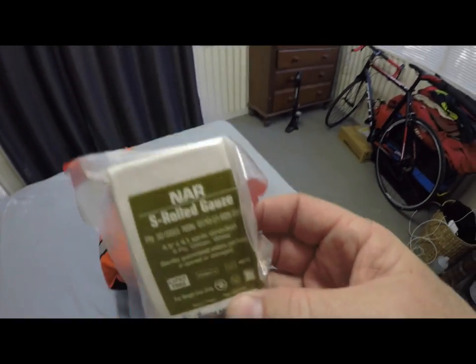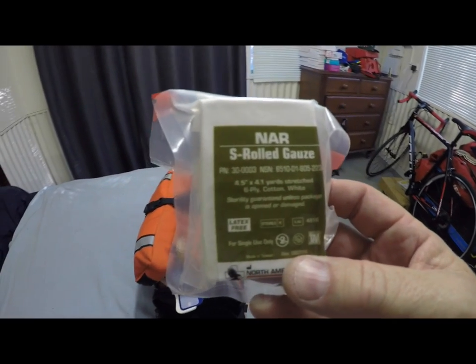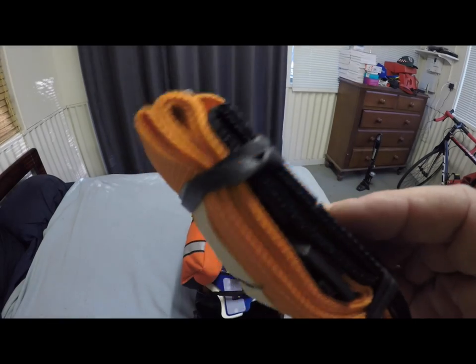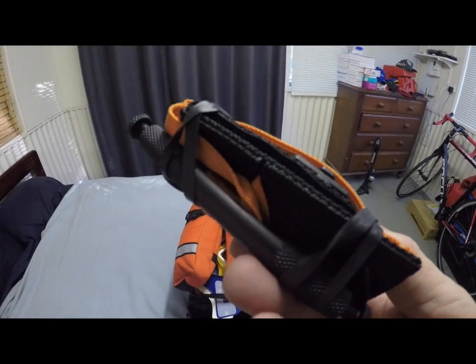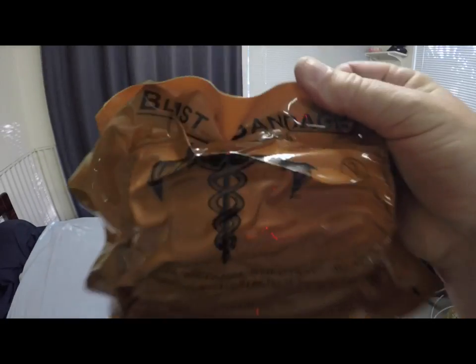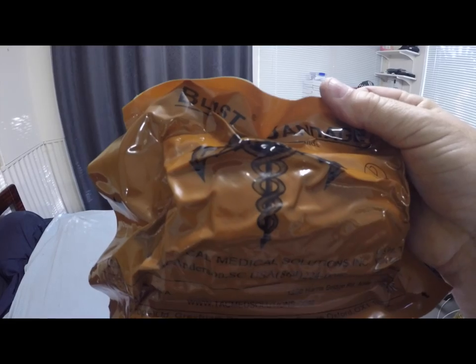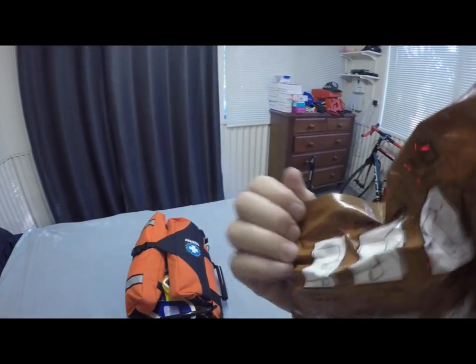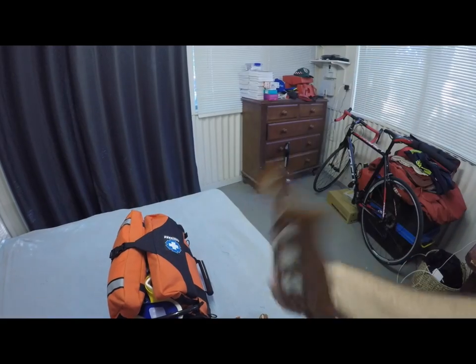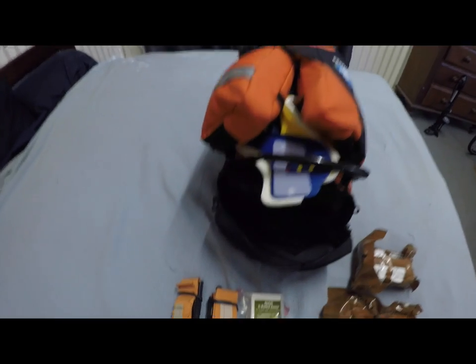In this bag we've got two compressed roll gauze — there will be a separate video on what you do with this. You have two combat tourniquets, and there will also be a separate video on how to deal with those. We also have two blast bandages, which are really awesome, and I'll do an entire video on how those work as well.